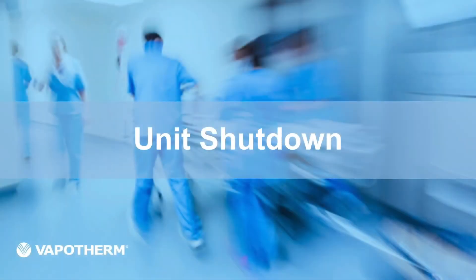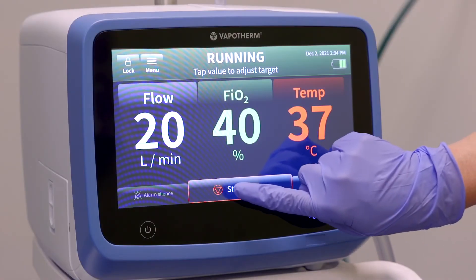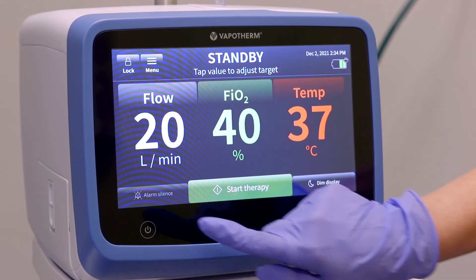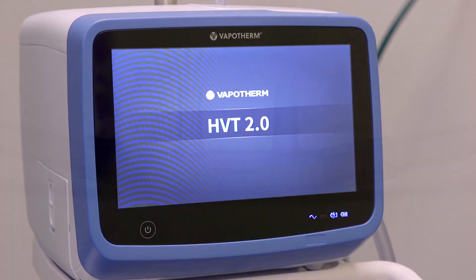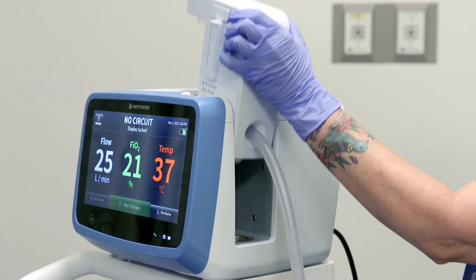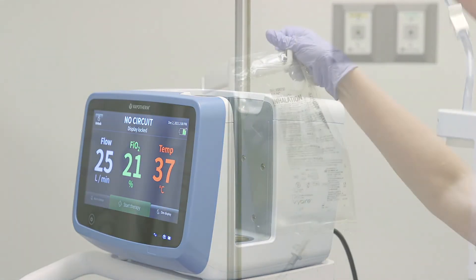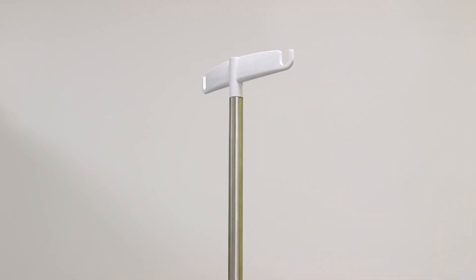Once therapy has been discontinued, remove it from the patient and prepare the system for the next patient. Tap the stop therapy button and follow the on-screen prompts to confirm stopping therapy. Press and hold the power button to power the unit off. Remove the cannula from the patient. Clamp the water spike, then press the latch on the disposable patient circuit to remove it from the docking station, while at the same time removing the sterile water bag from the top of the roll stand.